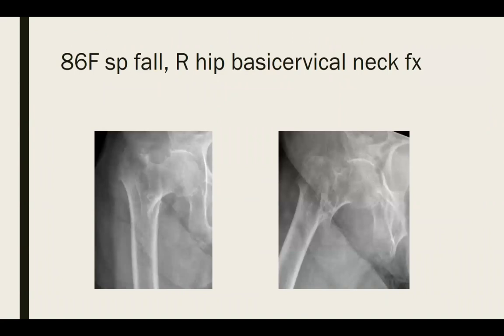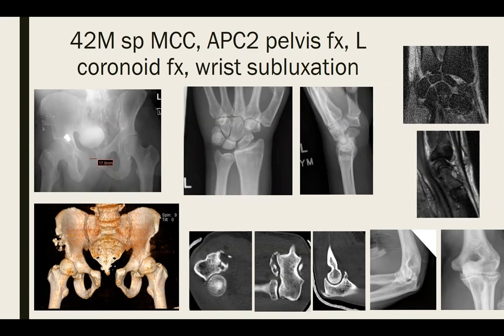Can you go back to the X-rays of the wrist? So the wrist is shifted ulnarly. Right. So if you didn't get a chance to read the latest article in the Journal of Hand Surgery, we wrote this up. This is on the translation of the wrist, which does not require an MRI. And if more than 50% of the lunate is not articulating with the radius, that's pathognomonic for ulnar translation. Plus this patient has the volar flexion sign.